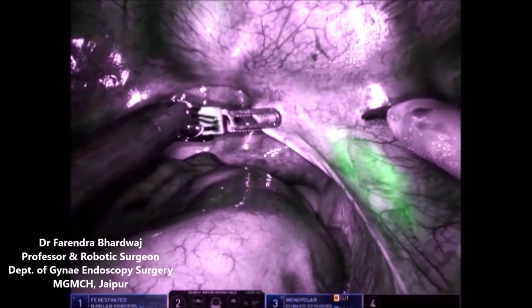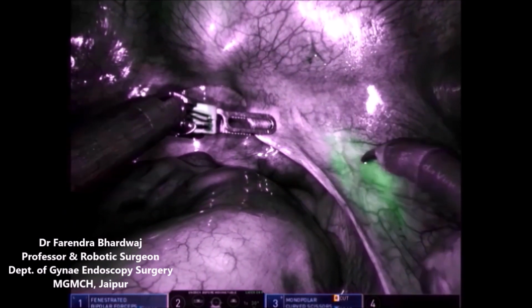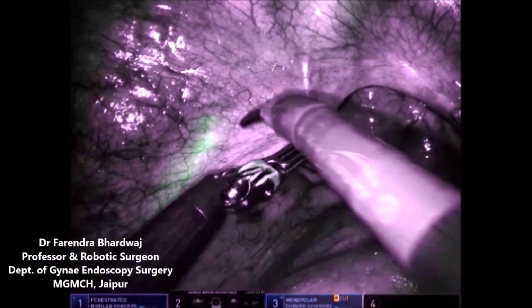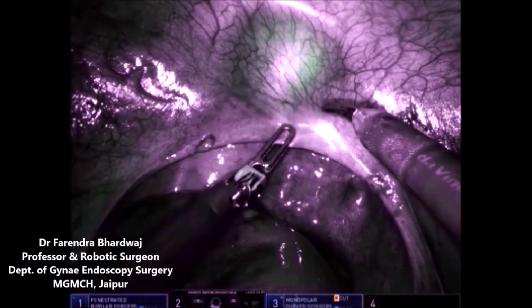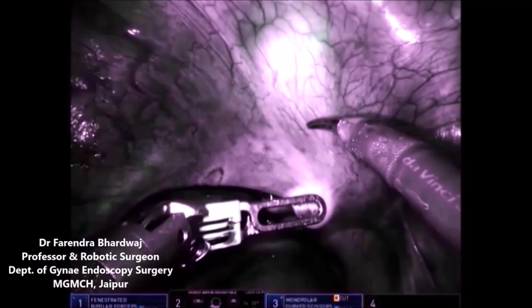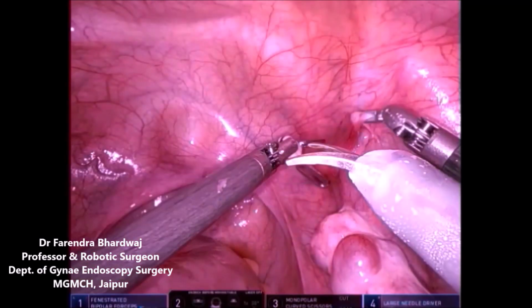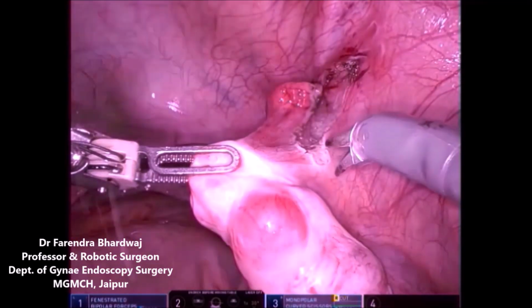You can appreciate how ICG is helping us in delineating the ureters on both sides, since this patient has a crossed renal ectopia of the left side where the ureter is crossing from left to right side. So this is how we are demarcating our surgical area where we need to excise the peritoneum to create a neovagina.